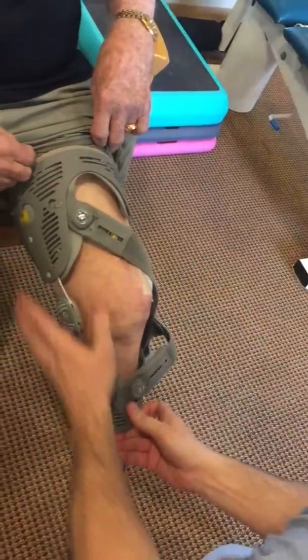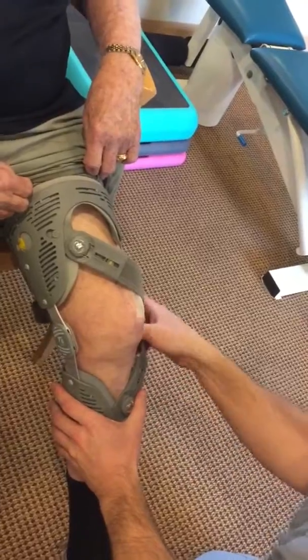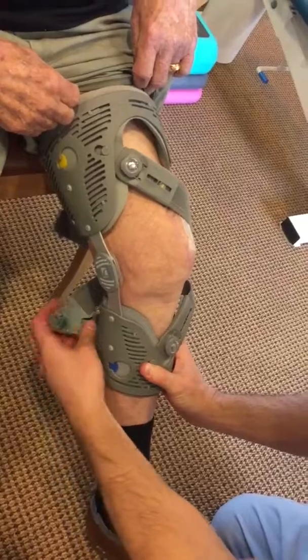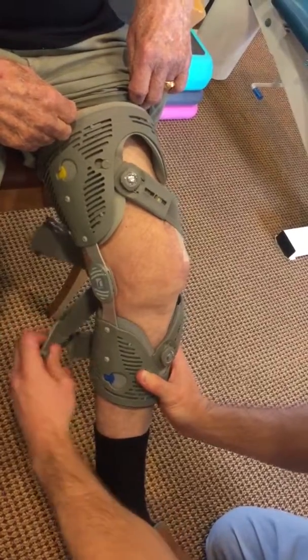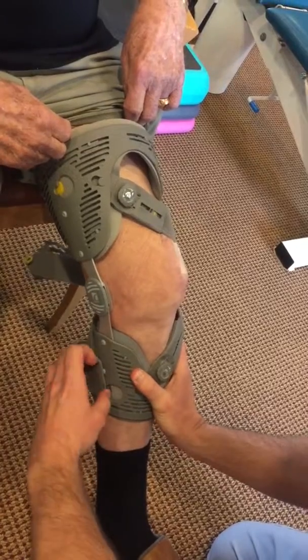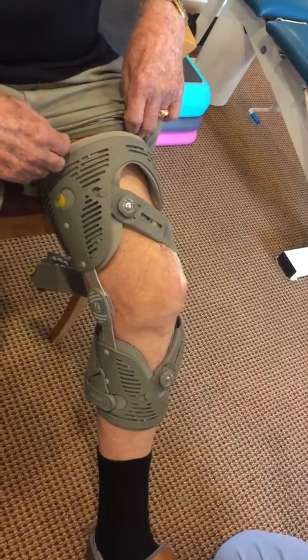We're going to bend the brace slightly, and I am going to find the blue circle first, which is here, and I am going to apply the blue circle into here. There is a release, so all I'm going to do is get the blue circle into the blue hole, then we are going to snap it closed, and the bottom is now applied.